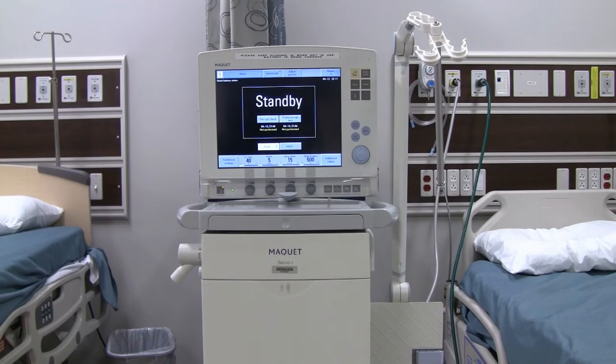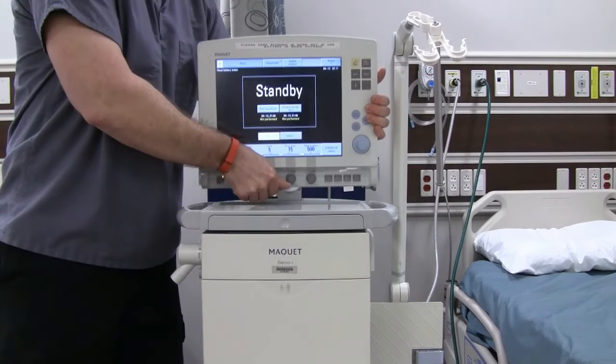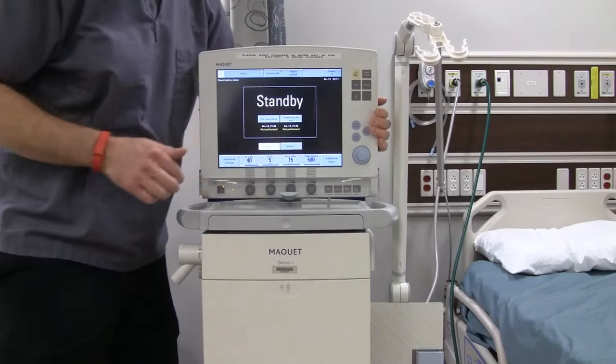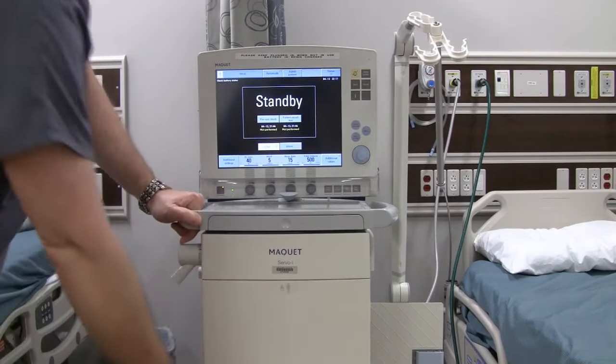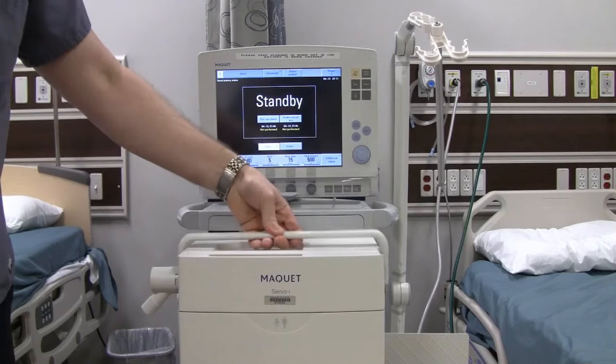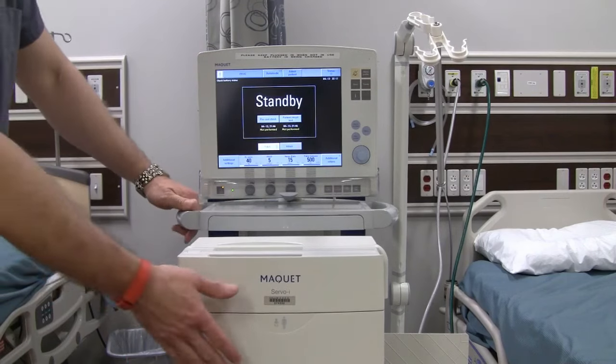The Servo-i is wheeled so you can move it around easily, and it's designed to be easily transferred to different areas. It can be lifted out of the mobile unit and mounted on poles, rails, or shelves, and can be safely mounted into the Servo-i holder on the wall or on the rail of the bed. There is a latch on the front of the monitor that you pull down to lift the entire monitor out, and a handle on the bottom of the delivery unit that allows it to be lifted out and carried in a holder on your bed or a pole.